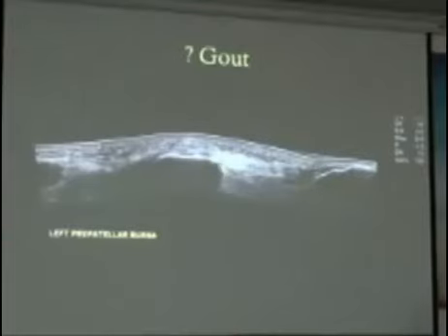And you can see here that the subdermal thickness just underneath the skin is quite thickened. And clinically, the knee was very hot to touch.